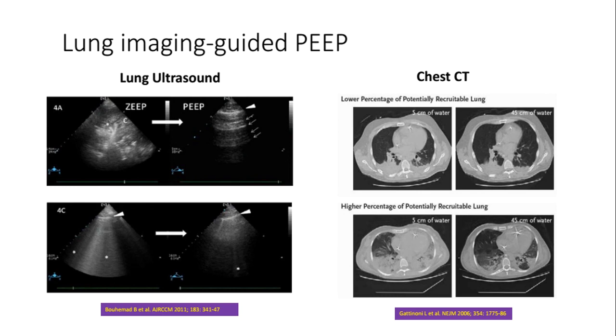If you have a patient of ARDS with a predominantly posterior distribution of collapse, consolidations, and so on, then giving very high amounts of pressure or a high PEEP strategy really won't help much. Why? Because a totally collapsed area really does not open, but the high pressures will be transmitted to your upper or anterior alveoli, which are going to get overdistended and cause further trauma. So what do we do with these patients? Let them die?